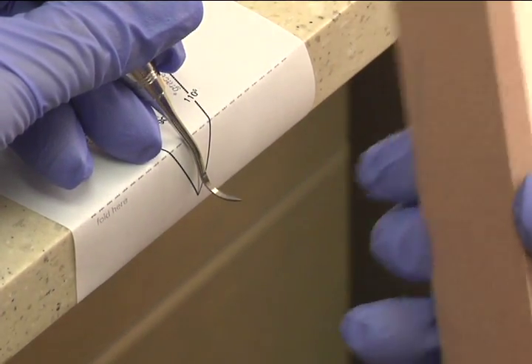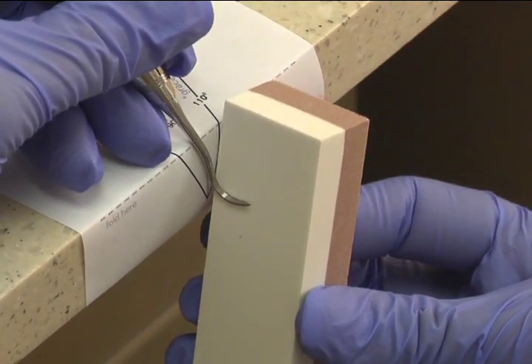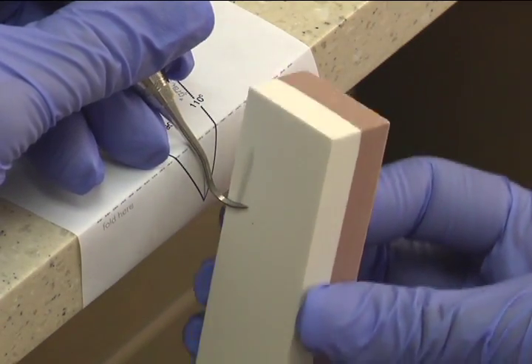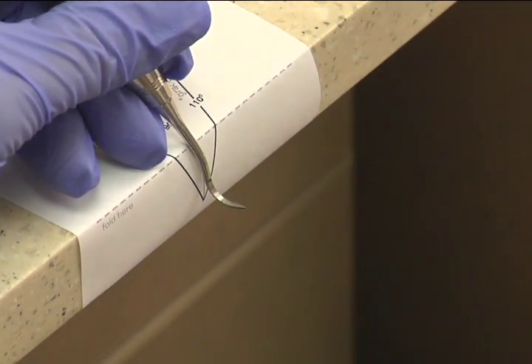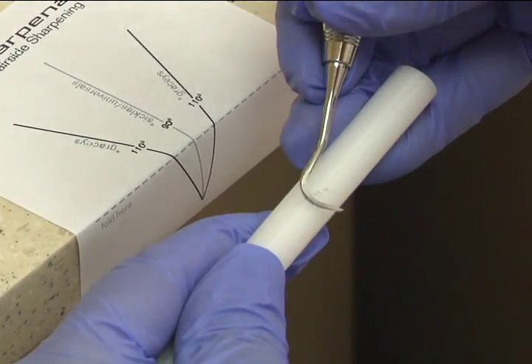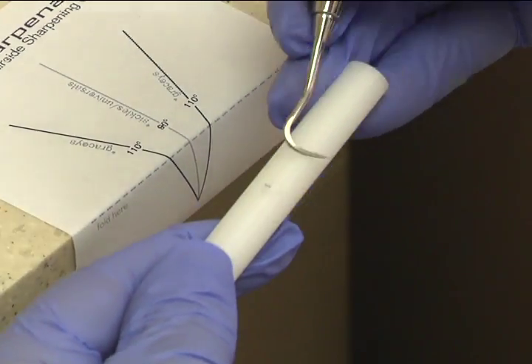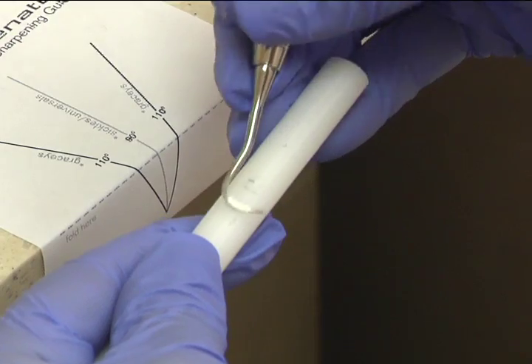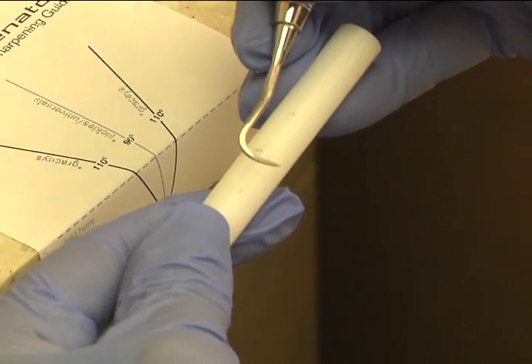Now, because this is a coarse stone, I'm going to turn the stone, and again, I'm going to finish it now with the fine medium side. If you're just maintaining your instrument, you don't need to do the coarse side. And that's that. I'm going to test for sharpness. I test the back, the middle, and the toe. So that grabs on very nicely. If it was sliding like this, then you know it's dull. But if I had this back part here and it was sliding, I would redo the entire blade. I wouldn't just sharpen the back, you have to redo the entire thing.